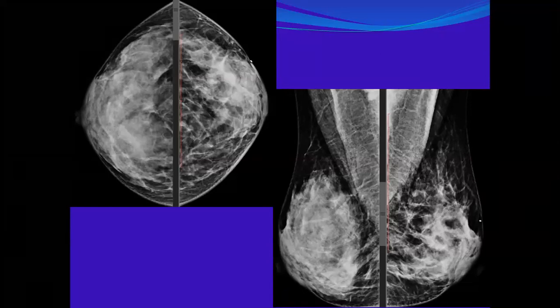Sarah, you said it could be a normal variant. Yes, it could be a normal variant. Excellent, well done. You are right. At the beginning, we said the asymmetry could be a normal variant or could be a sign of cancer. So how could we differentiate it from other diseases? This is a global asymmetry. When do I call the asymmetry BIRADS 1, BIRADS 2, BIRADS 3, BIRADS 4 or BIRADS 5? I have to review the previous mammogram.